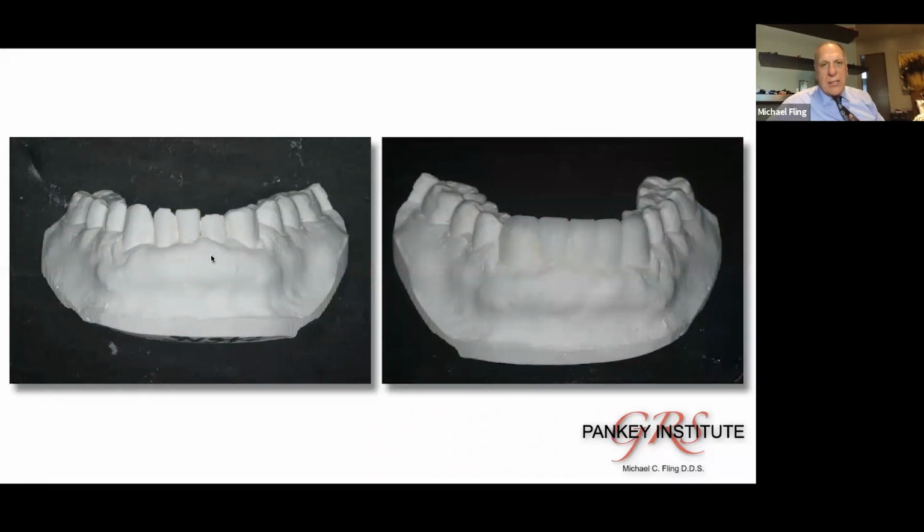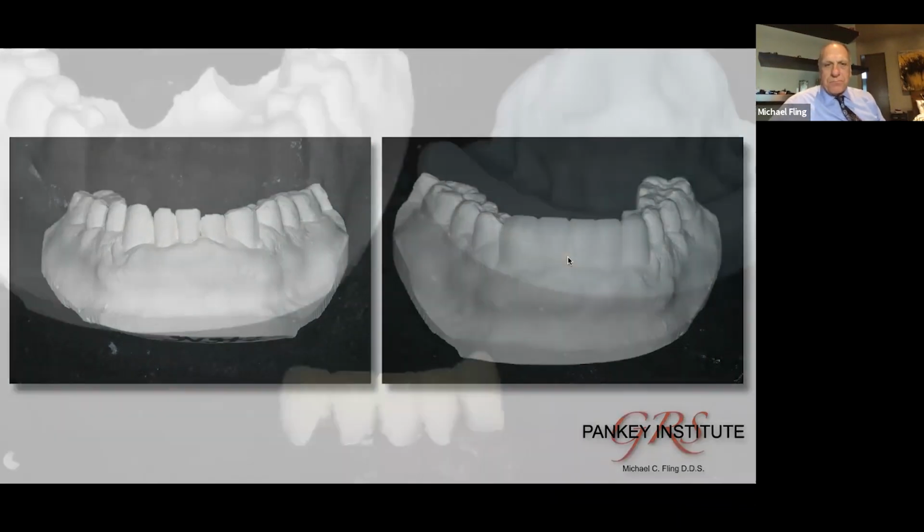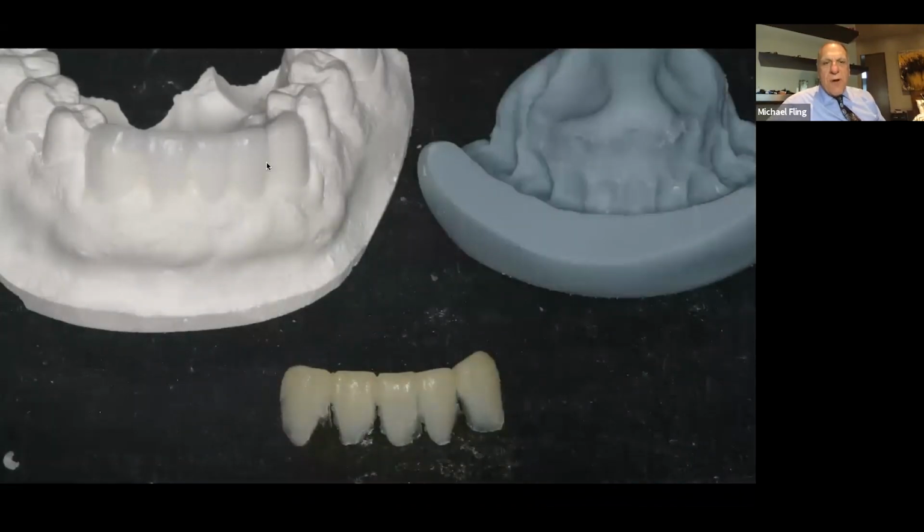There was a lot. I really played at this point with this wax up, trying to determine if I wanted 3 or 4 incisors. I waxed it up and I ended up only putting 3 of these in instead of 4. I did my wax up. Here you see from my wax up, I have a shell that I made right here. This is my Siltec index material that I made. And this is a thin shell.